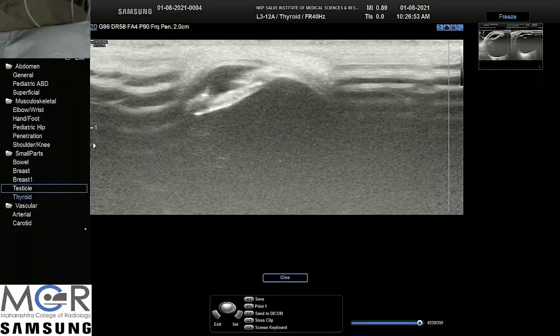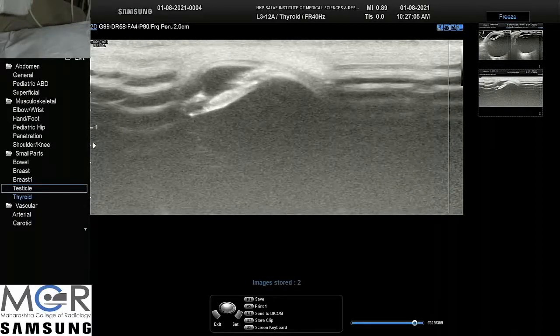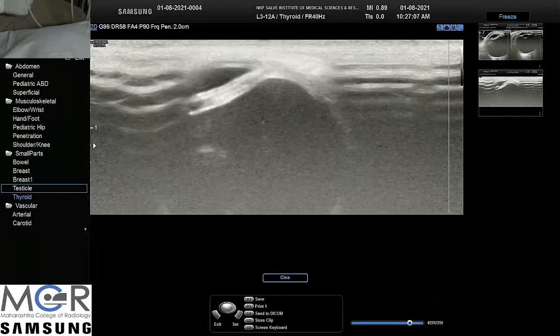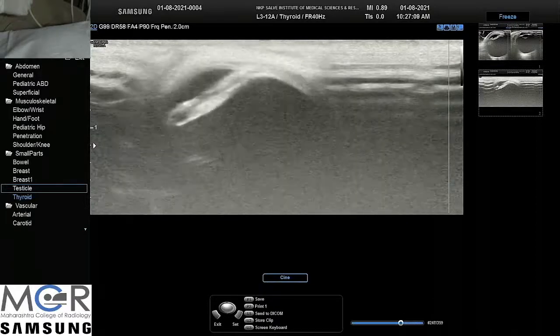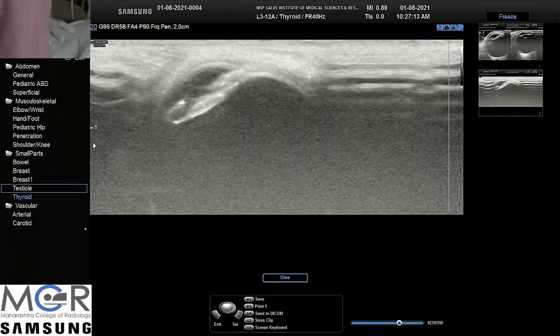So the added information we have given to them is, because of that cataract they are not able to see the posterior segment, and we have informed them that there is no injury, no consequence of injury as far as the posterior segment is concerned, and they may proceed with cataract removal or lens IOL implantation in this patient whenever the patient settles.